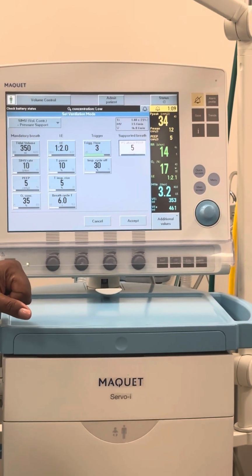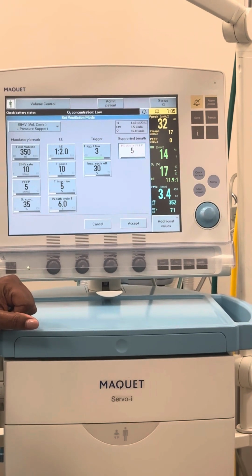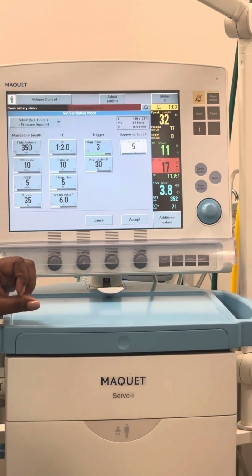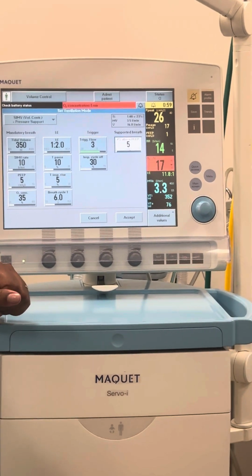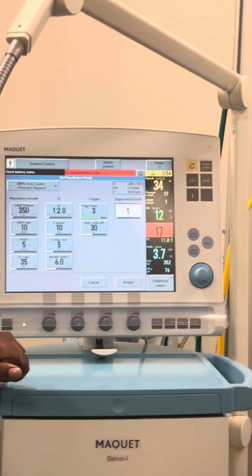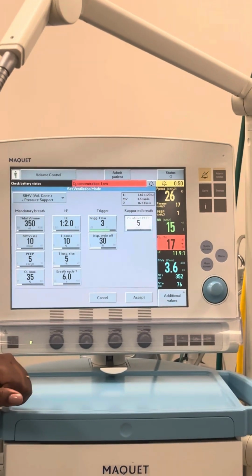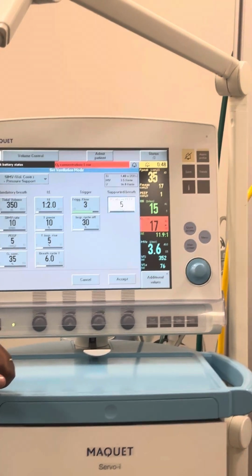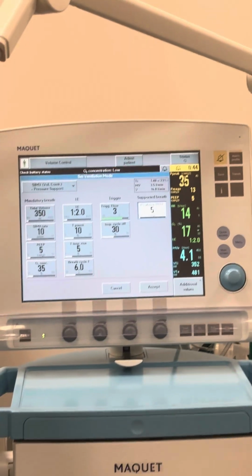This one is pressure support over PEEP, so it would be 10 over 5. The Servos read them that way, I think. The Hamiltons read it so you are actually giving them 10 on this one. This one does not say that, but this one does. So this one is true: whatever number you put in is what you truly get. This one, you have to know how to add.